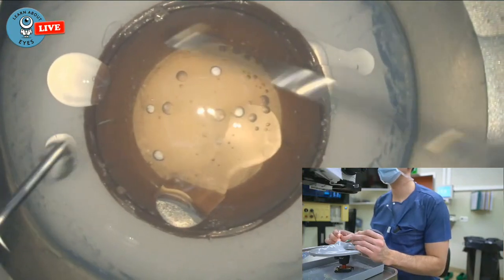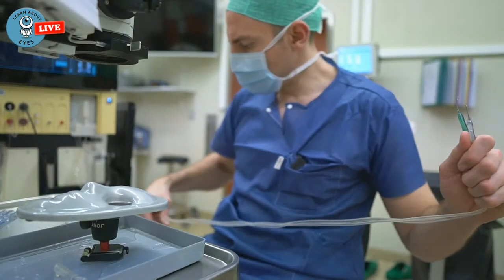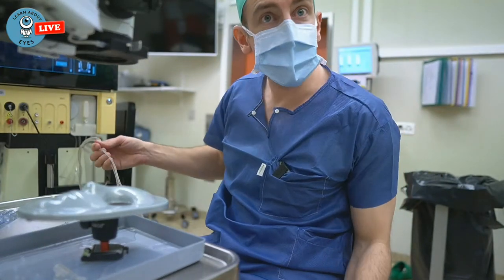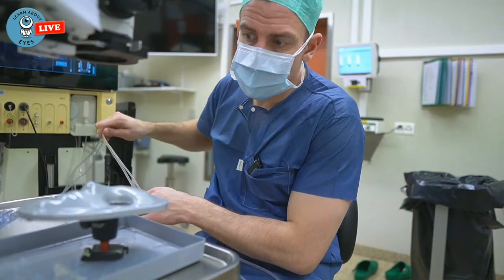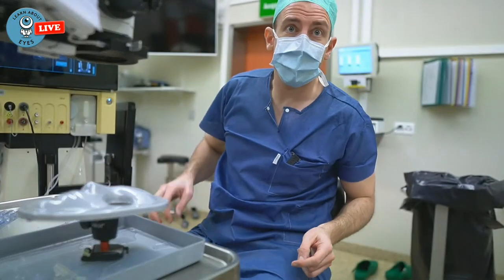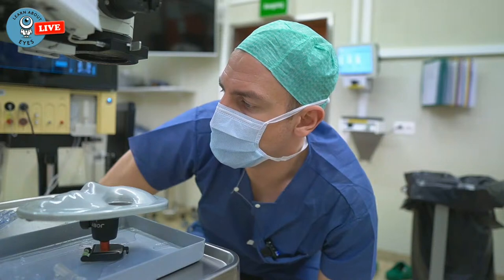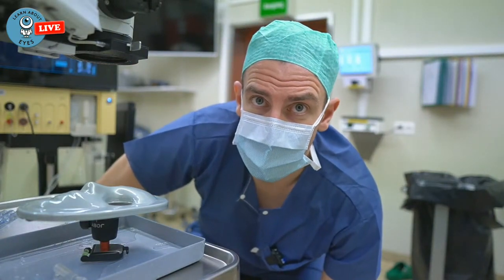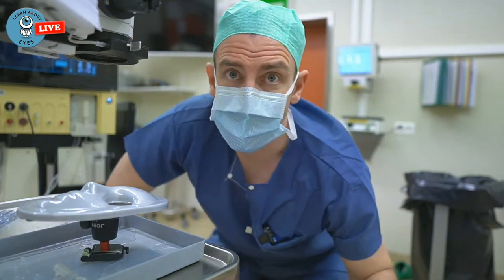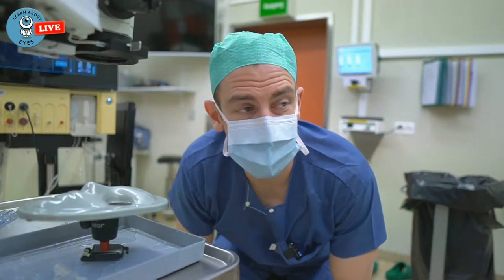And then you would be implanting something into here, probably. Now I don't really have normal implants here right now, but I'm working on an idea on how to practice YAG capsulotomy for people without hitting the lens, without creating pits, for the residents. So, as the last part of this live stream, I'd like to think of an idea of how to implant the lens with a posterior capsule opacification that you can laser afterwards. So if you have any ideas, you can totally participate. Maybe my residents will be happy about it afterwards and you can help them get better at laser.